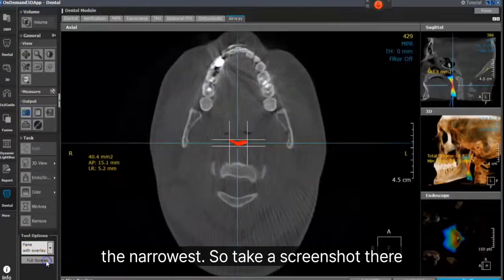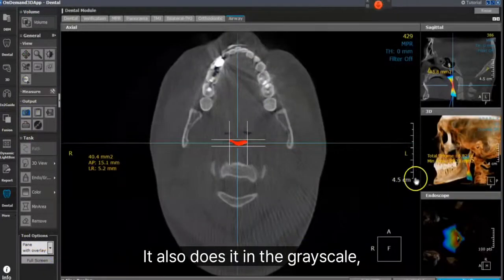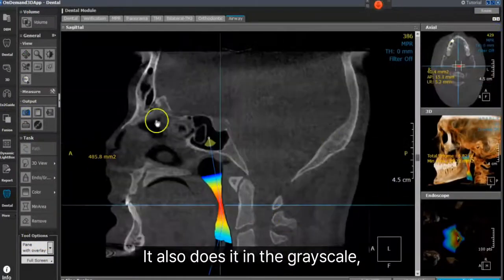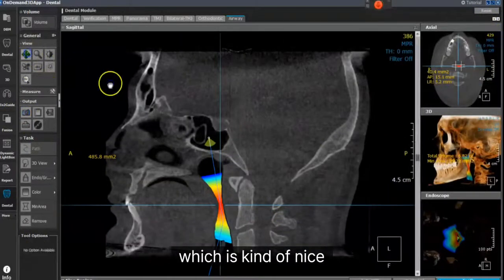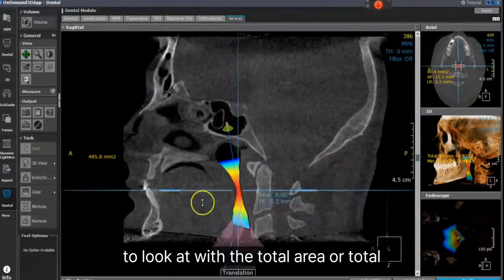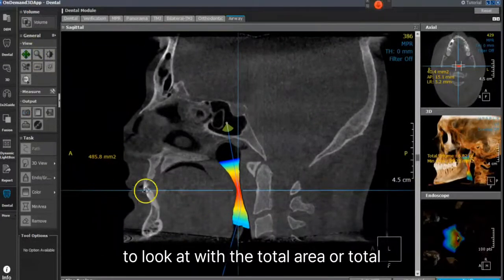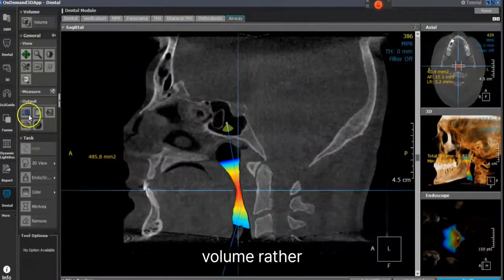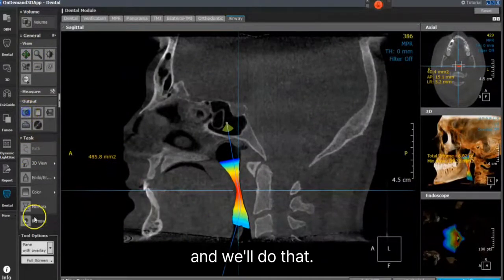I'll take a screenshot there as well. It also does it in a grayscale, which is kind of nice to look at with the total volume, and we'll do that.